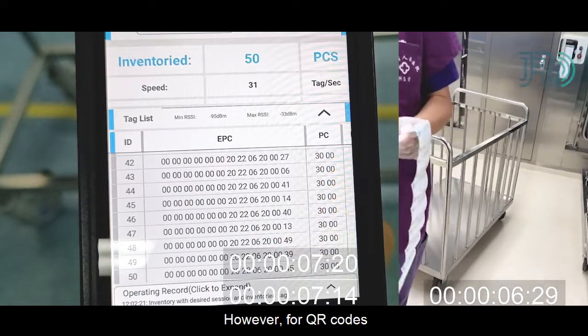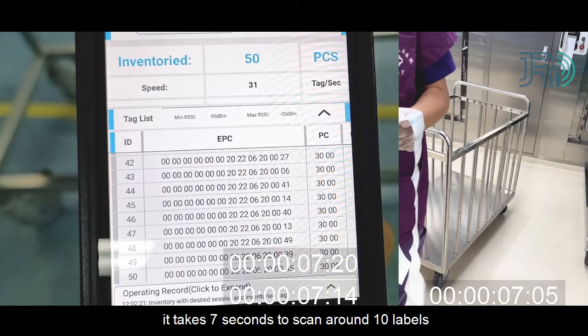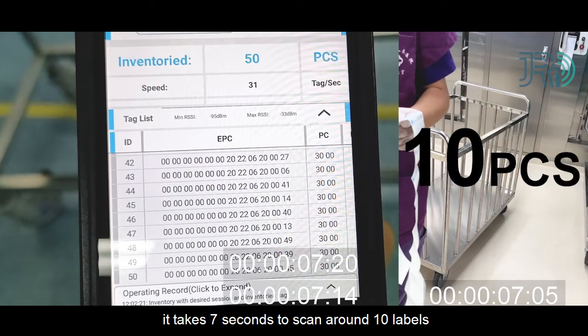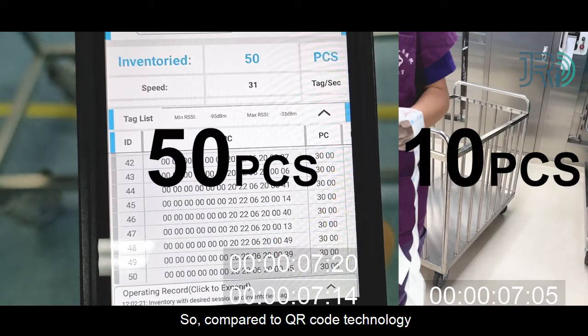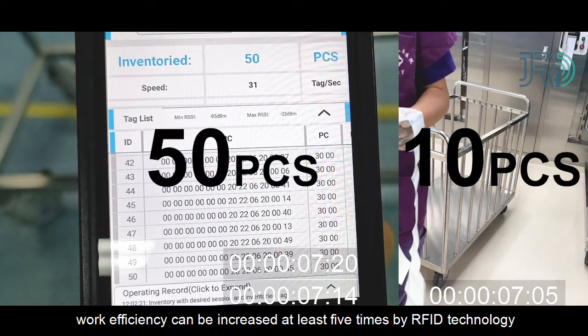However, for QR codes, it takes 7 seconds to scan around 10 labels. So, compared to QR code technology, work efficiency can be increased at least 5 times by RFID technology.